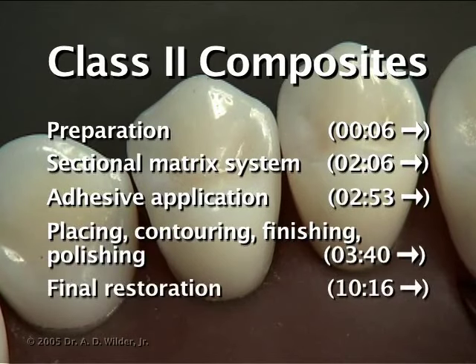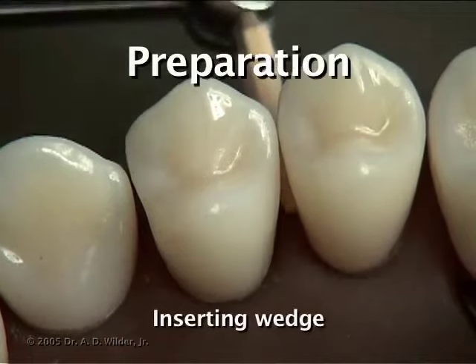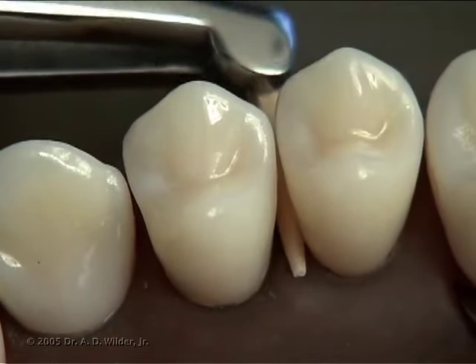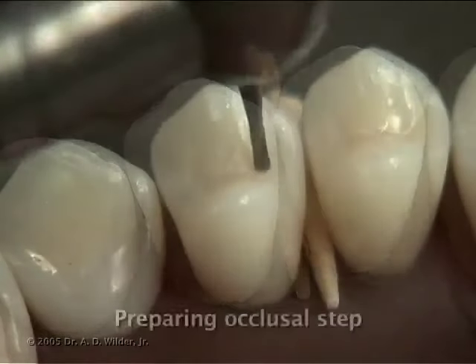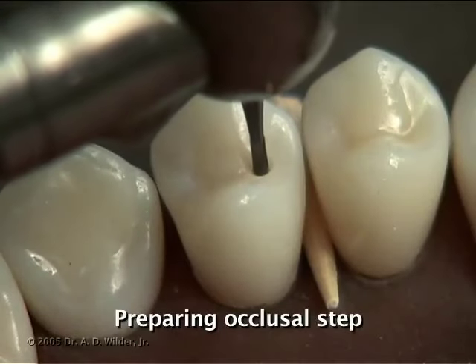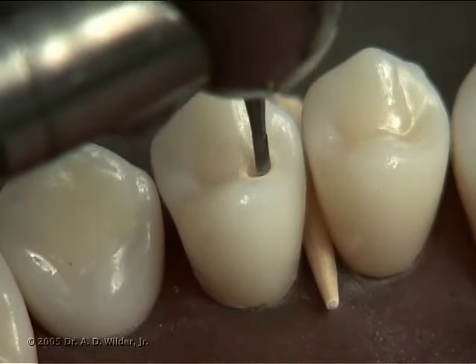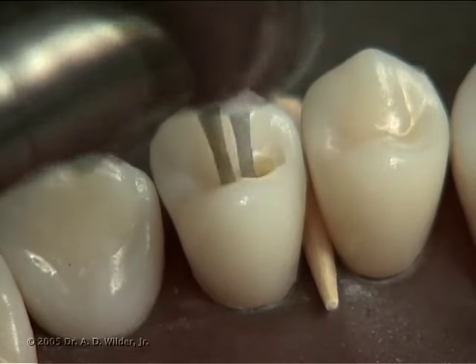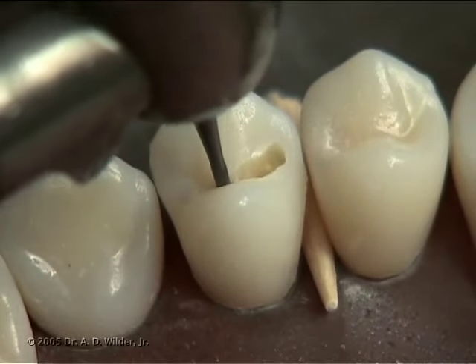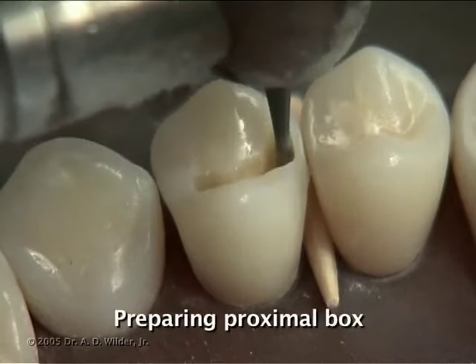For Class 2 restorations, you can slide a wedge underneath the proximal contact, in between the tooth you're working on and the adjacent tooth, prior to starting the preparation to help protect that adjacent tooth. Start with the occlusal step and penetrate the occlusal surface to a depth just inside the dentin enamel junction. Extend mesiodistally and buccolingually while protecting the integrity of the cusp tips with the goal of removing caries.